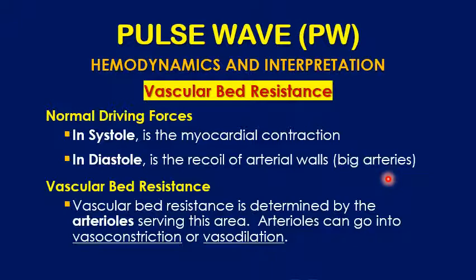When the systolic wave goes inside the artery, it creates a little distension, a little stretch over the artery's wall. This stretch happens because the tunica media of the arteries has smooth muscle fibers and elastic fibers. These elastic fibers are capable of stretching and recoiling back. When they recoil, they help keep the flow going forward because they deliver this energy back to the blood. So the arterial wall gets some energy during systole and returns it to the flow during diastole.